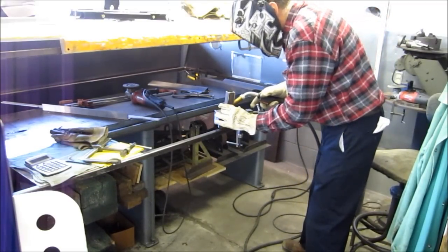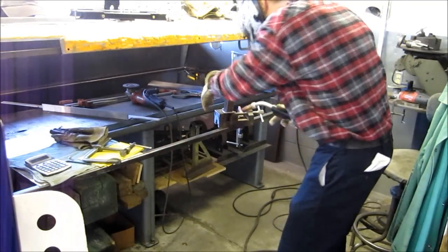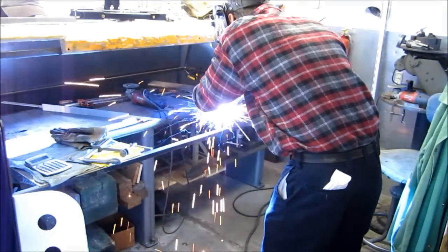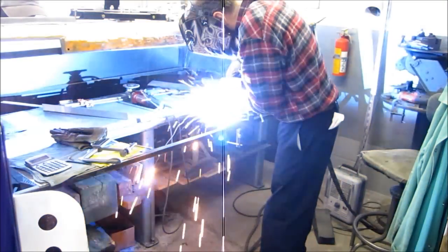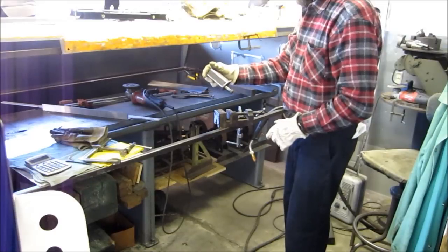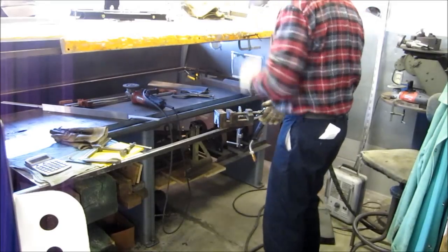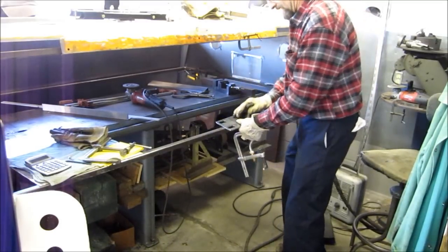I'm going to put a couple of good tack welds on here just to make sure. All my tacks need to be good and strong — I'm going to mount this right onto the wheelchair and cram it into the hole, and I want to make sure I don't break anything loose. I'm going to get this other plate in here. This job has got a lot of great flat spots on it.